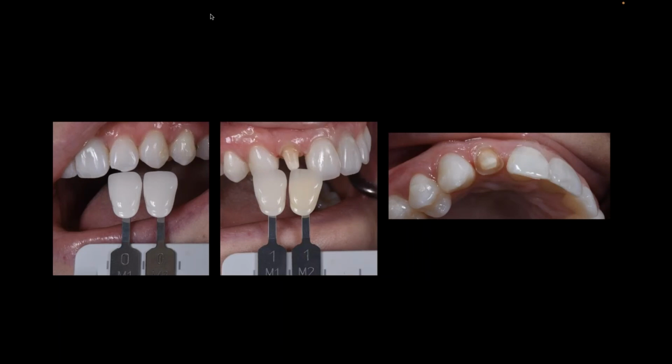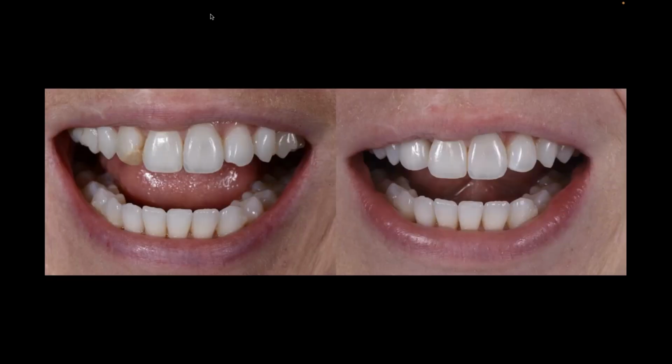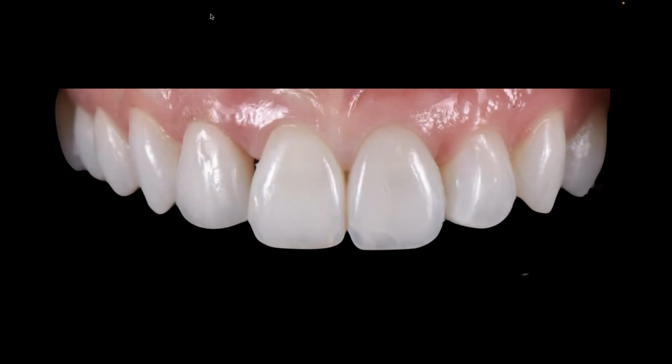So I'm taking the contralateral side. I want to see the coloration of the number 10 for me to work through my number 7. I also want to see what the prep shade is, so I know if that's going to influence what I'm working on. I'd also like to photograph not only the adjacent central and cuspid, possibly even the lower, and I would also like to do that under polarized, so I can get a different effect of what I'm seeing inside that tooth. And then we'll fabricate our final restoration, and hopefully we can make that blend and harmonize with what the patient has.